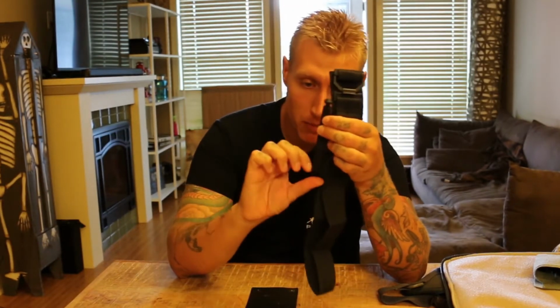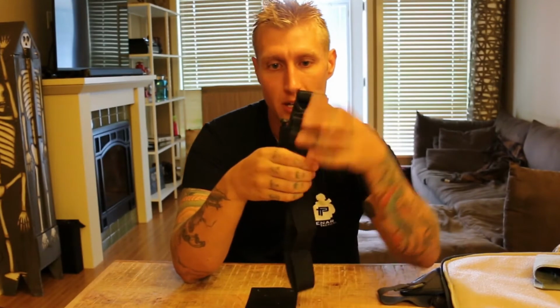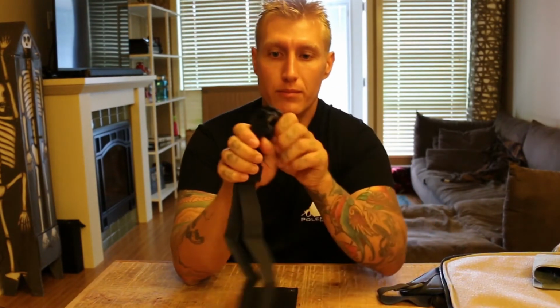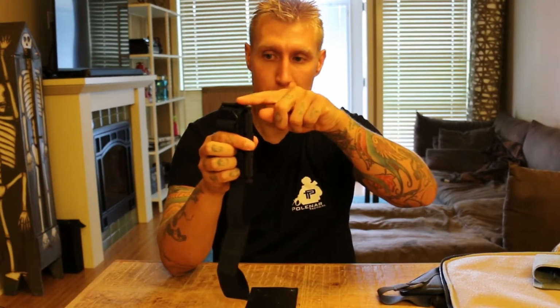This is important because this is going to allow me to judge where I need to fold the tourniquet up here in this section so that the tourniquet in no place is any wider than the windlass. So I measure the windlass down from the bottom and I see where it goes up here at the top, and that's roughly where I'm going to fold it in half. It's going to be pretty close to this buckle right here, being the same length. So as you can see, it starts at the bottom and it goes up to this metal buckle. So if you're somewhere around there, you're doing pretty good.